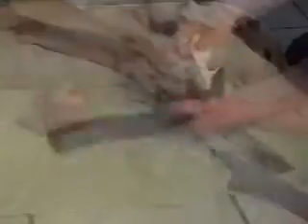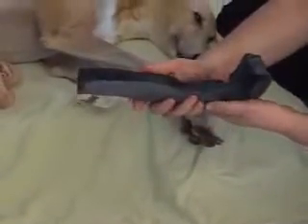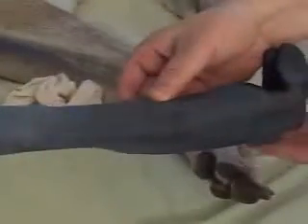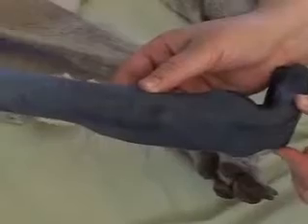Carefully remove the splint and the cotton stocking. As you can see, the splint has retained its shape. The splint draped smoothly over the animal's limb and contoured to its shape, thereby limiting pressure areas.